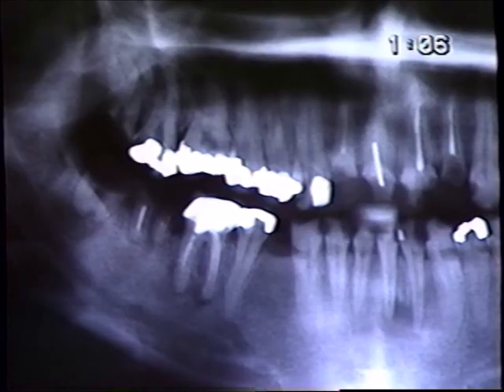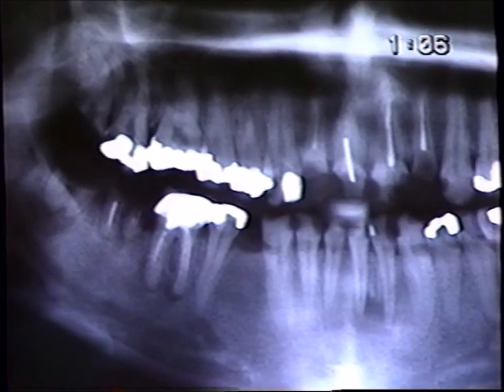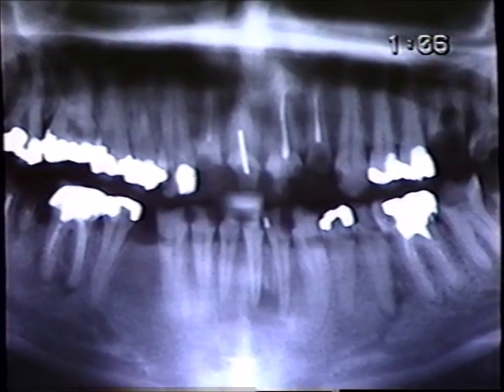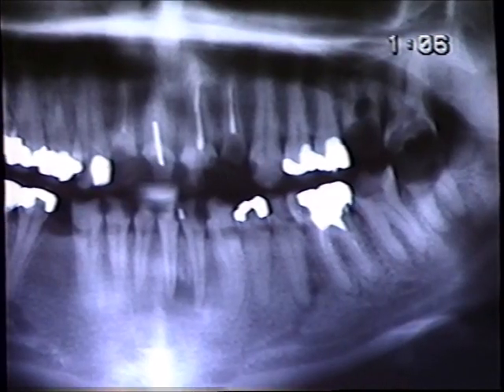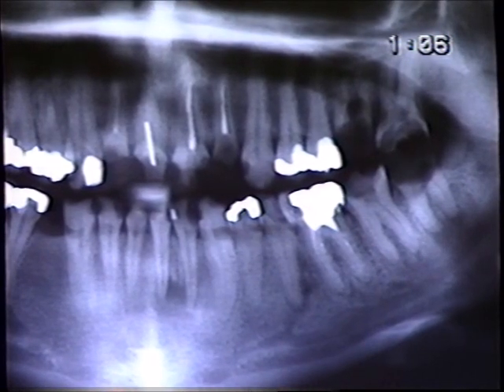We've got a third molar that's completely decayed down below the bone level, carious second, first, canine. Looks like a lateral here that's at the gum line. There used to be a crown on that one, number 9. Number 7 and 8 are pretty well gone.